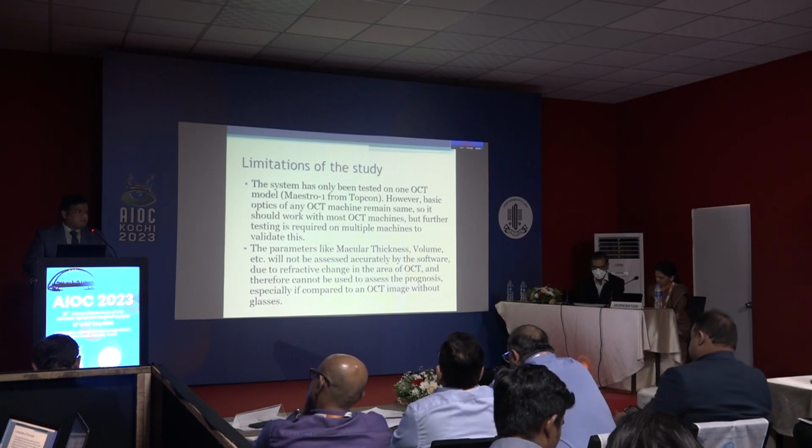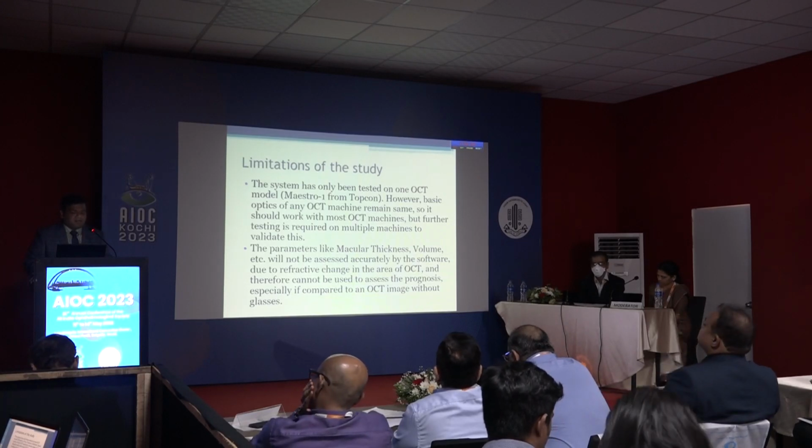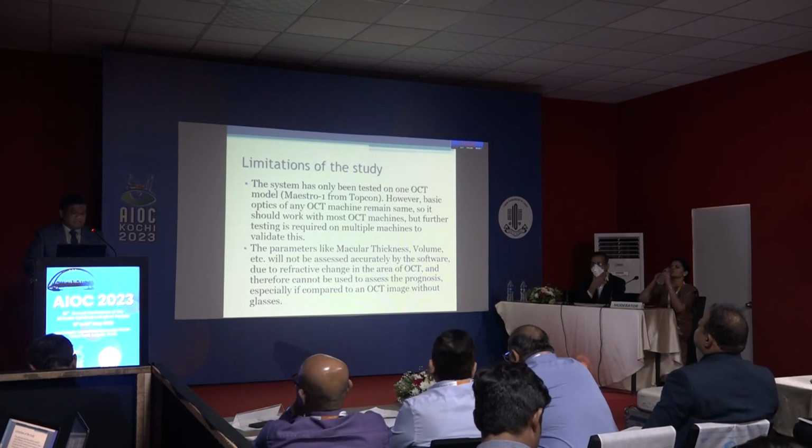However, basic optics of any OCT machine are the same, so it should work with most OCT machines. The parameters like macular thickness, volume, etc., which are assessed by the OCT software, will not be consistent since the software is not configured for using an extra lens.